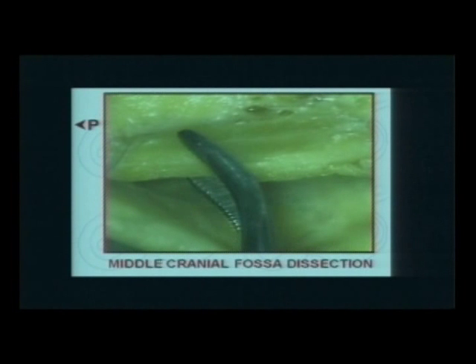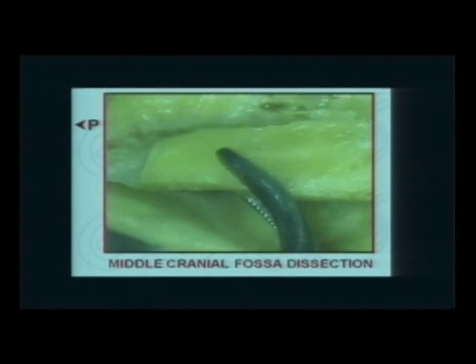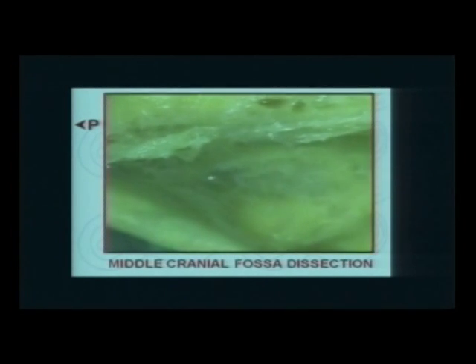In this 3 minute video, I'm going to remove this edge of bone on the temporal bone from above and look onto the roof of the temporal bone. Greater superficial petrosal nerve and superior semicircular canal, arcuate eminence, and greater superficial petrosal nerve.